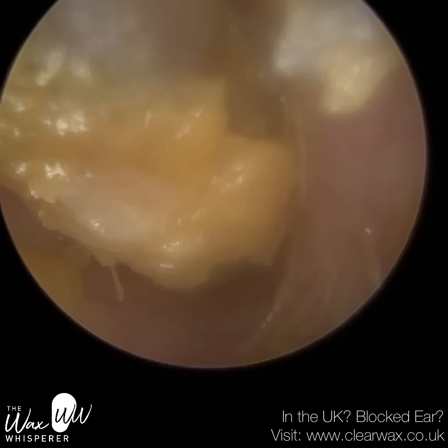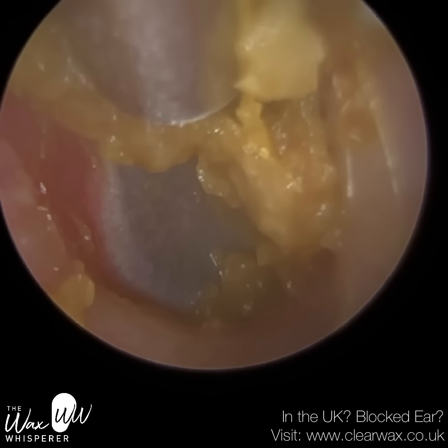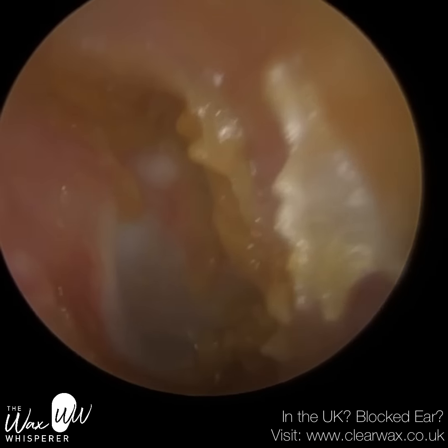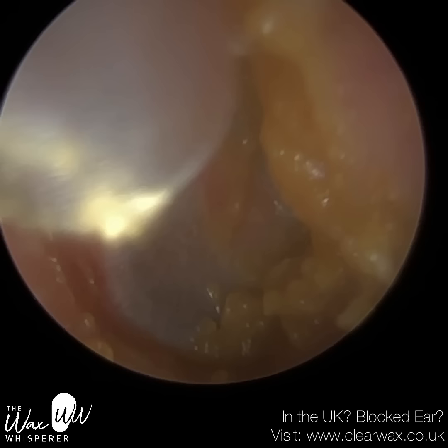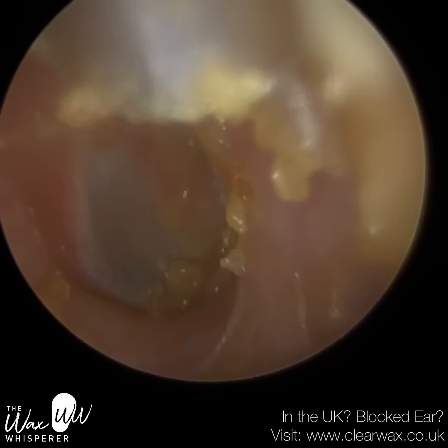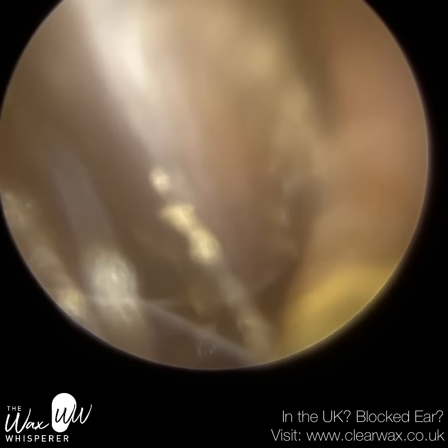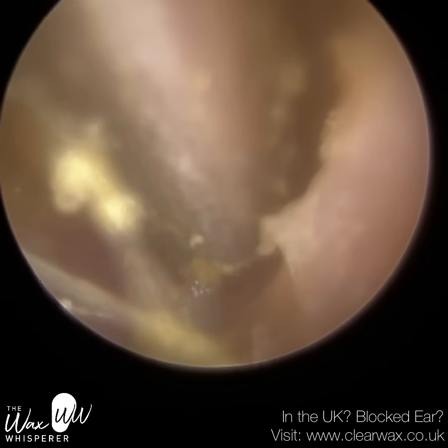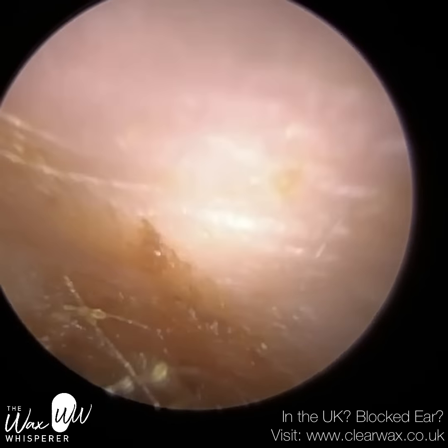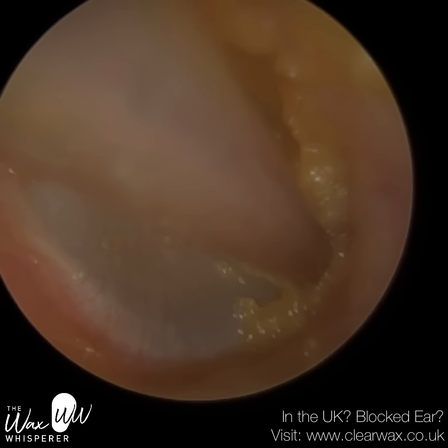I've removed all the lateral debris and we've just got some residual debris on the eardrum. It's really, really sticky. You can see the back part of the eardrum — that blue tinge. After I move this plug, the patient has got some debris again in that anterior recess region. This anterior recess is just a bit more prominent. I'm having to curl around the front part of the ear canal — that's the anterior canal wall, and the anterior recess is hidden behind it. If we make contact with that anterior canal wall, because it's in the bony part, it would be really uncomfortable for the patient.